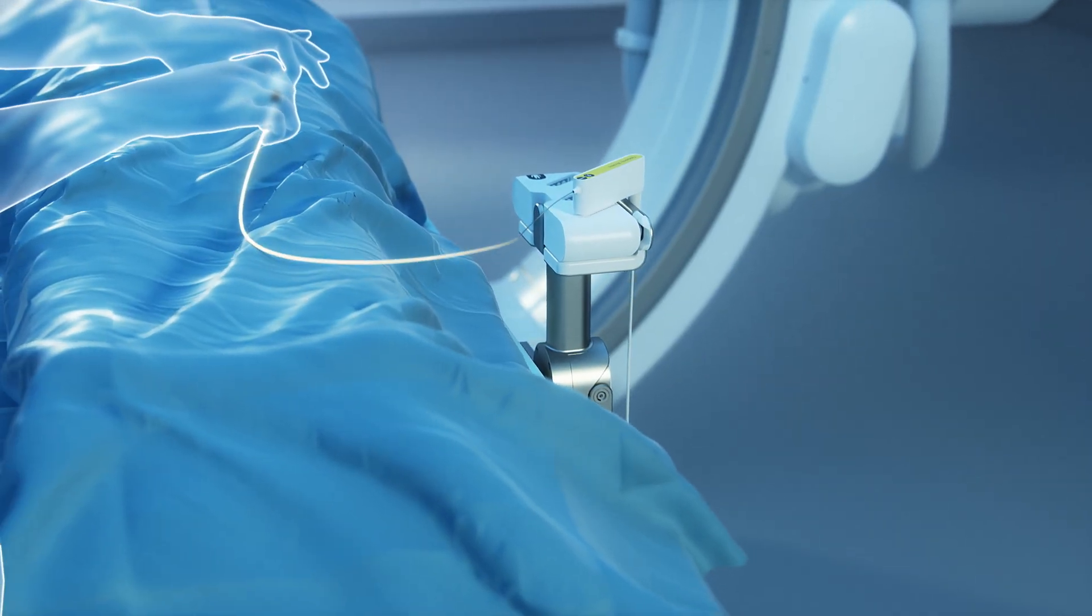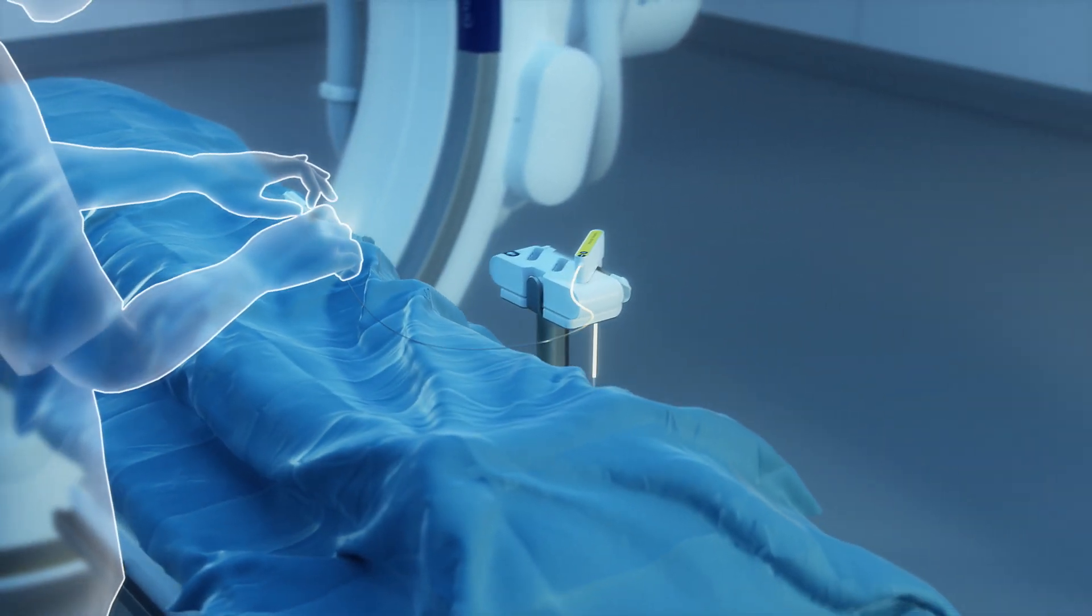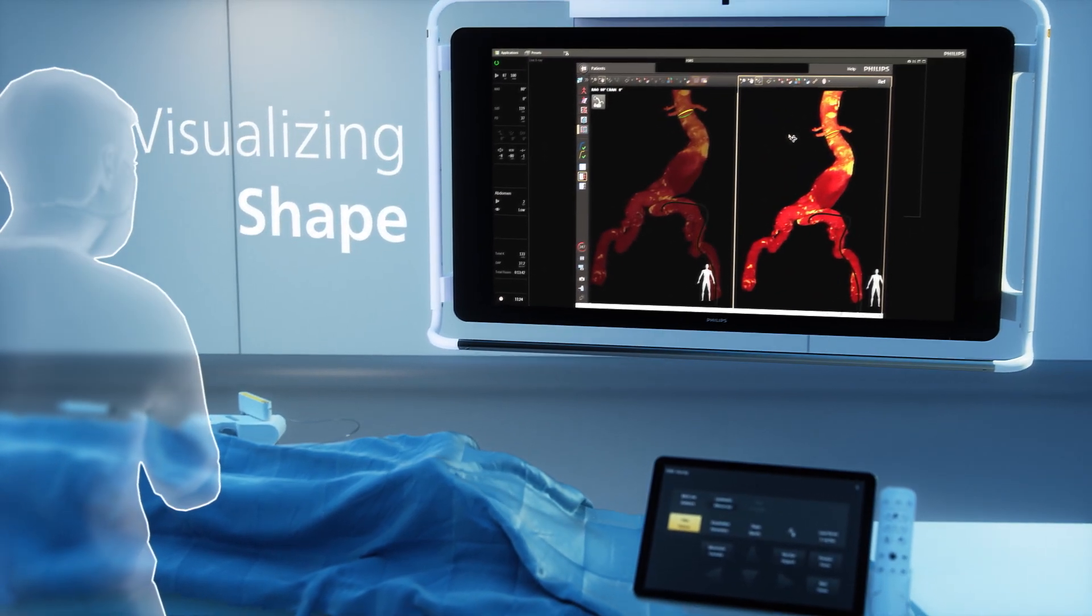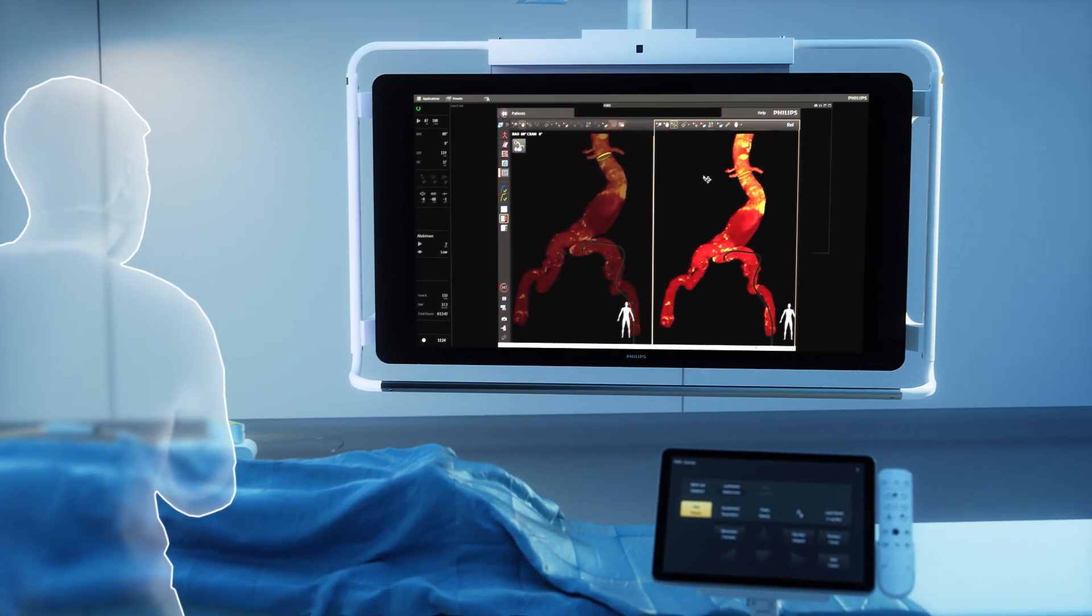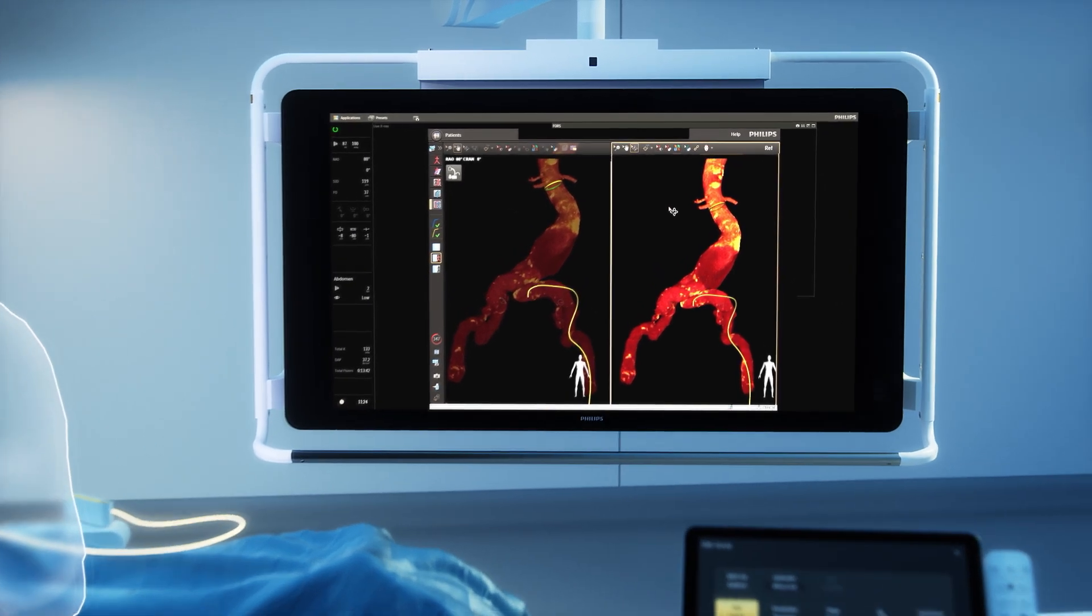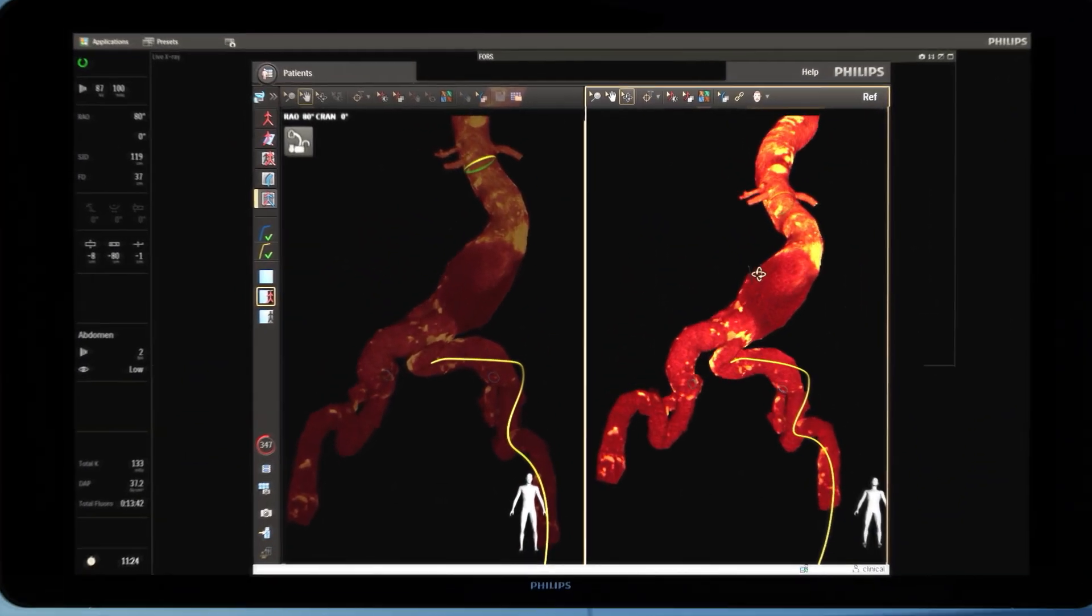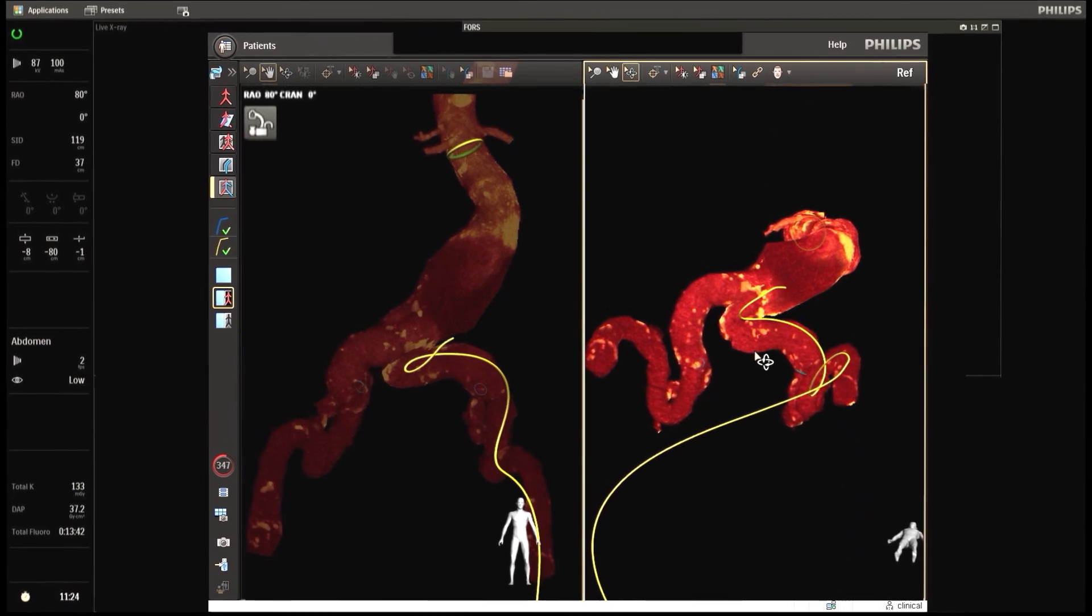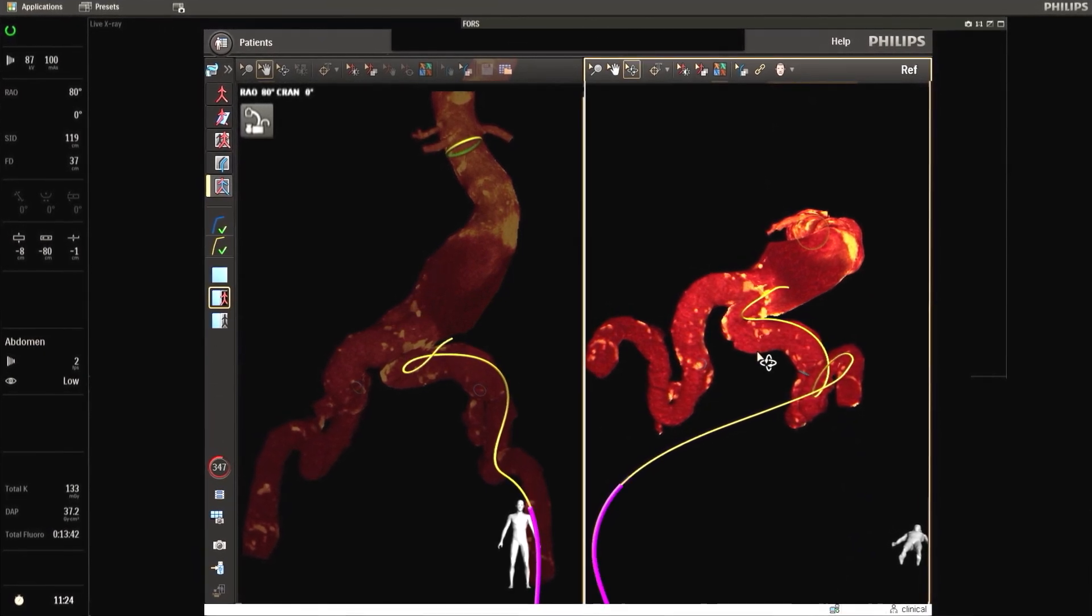This is translated into continuous real-time 3D visualizations seamlessly overlaid onto pre- or intraoperative images like CT or X-ray, and viewable from any angle. Devices are shown in distinctive colors.